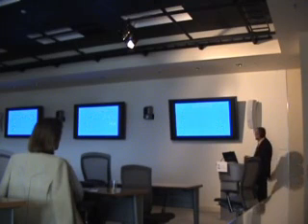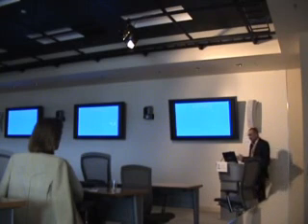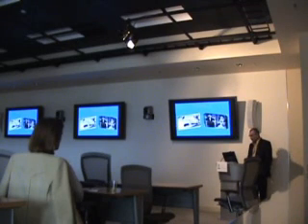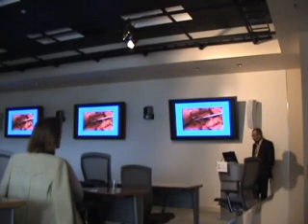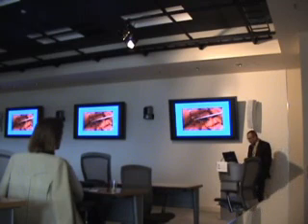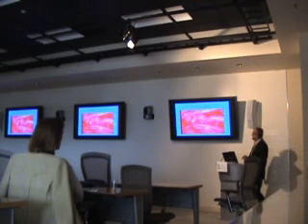Now, Professor Yasargil and Sebastian as well called it a virtual model. I like to call it the live cadaver model. But of course, I don't mean this or this. What I mean is this. So, applying some features of live surgery to a cadaver model in order to practice live surgery on a cadaver specimen.